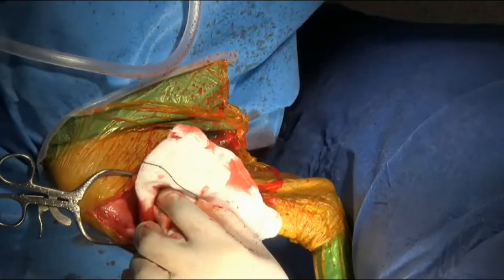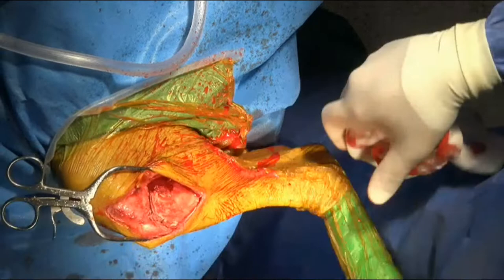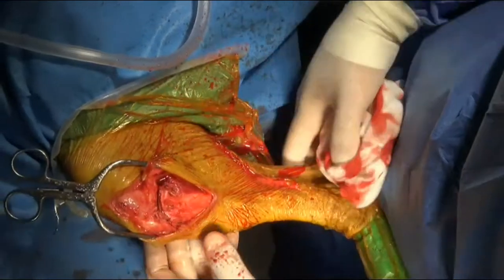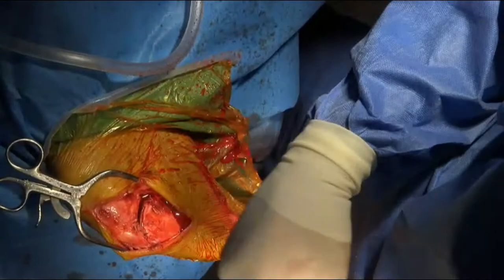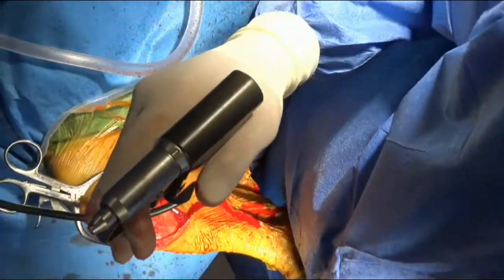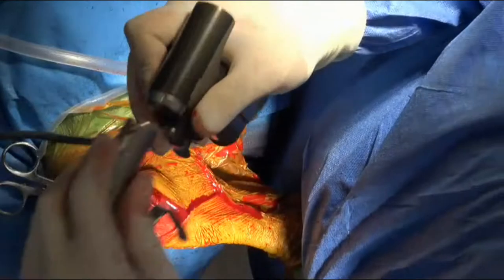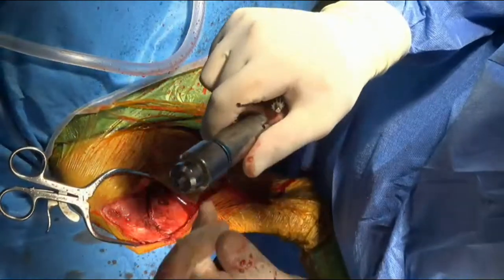So, Jess, I'm just going to hand this saw off. The back of that saw just came off and hit Yui, which is why it's unsterile. Okay, so now we've made our cut. It's kind of like an upside down TPLO, I guess. And then we'll actually get a 1/8 there. Ain't going to work in that one. So we're just going to switch over and put a pin in a Jacob's chuck here.